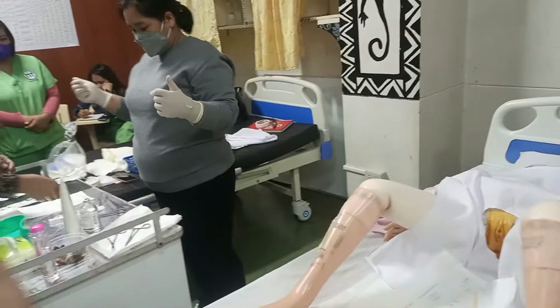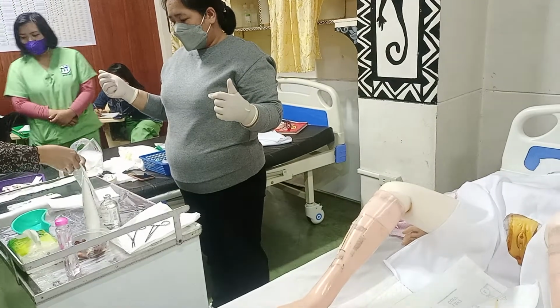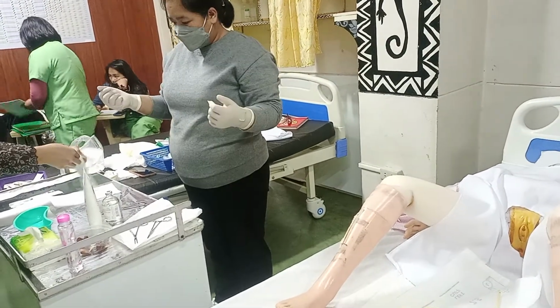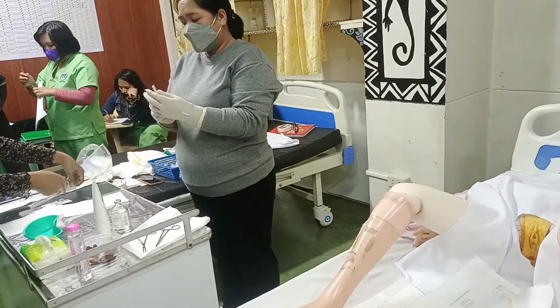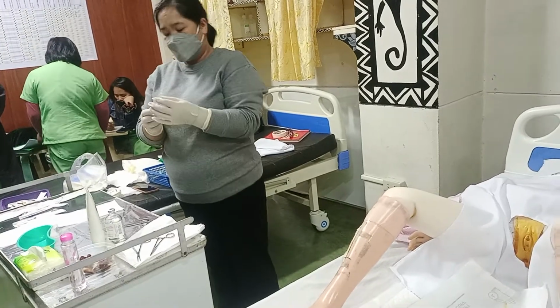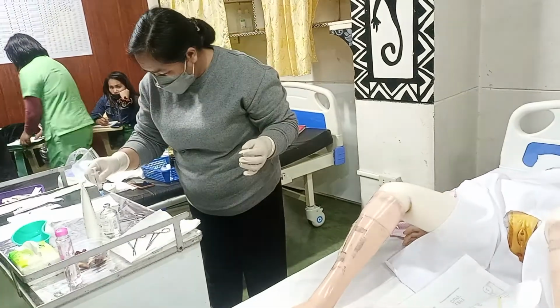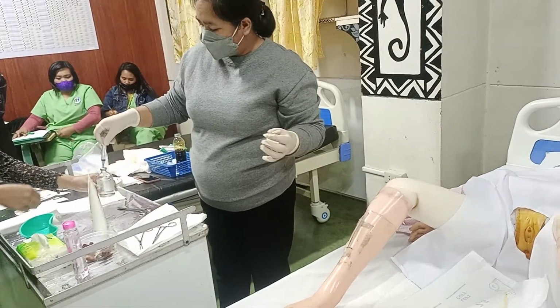Ma'am, next. Yes. Okay, get it. Check mo yung parts. Sige ma'am, pakitaas ito, yung bote, and I will not touch my syringe.